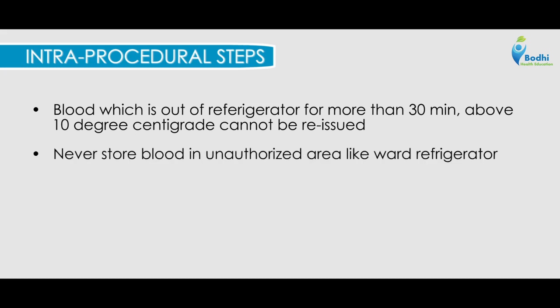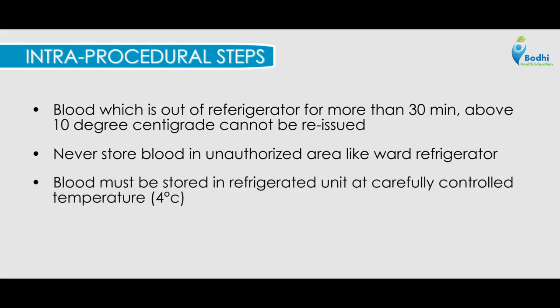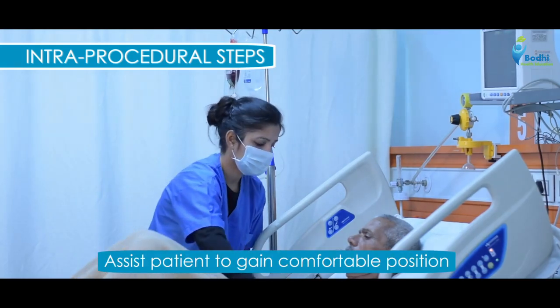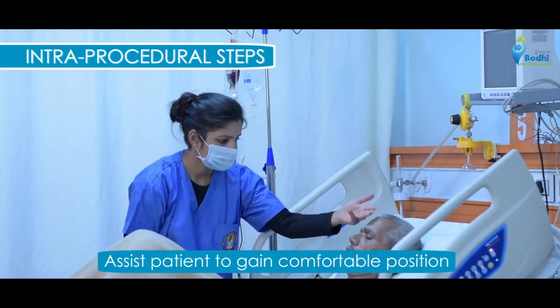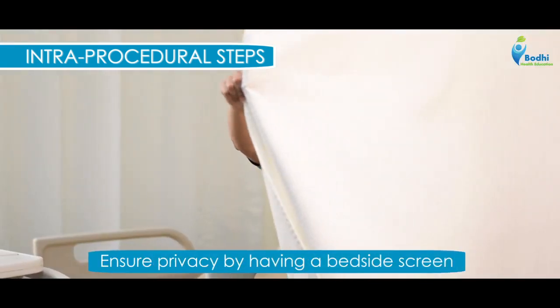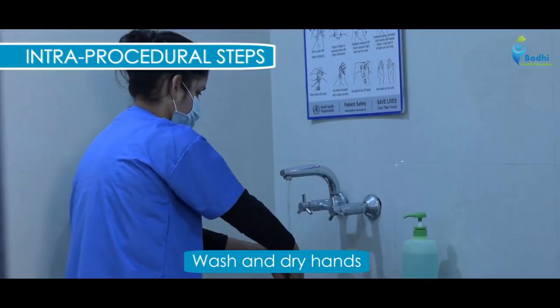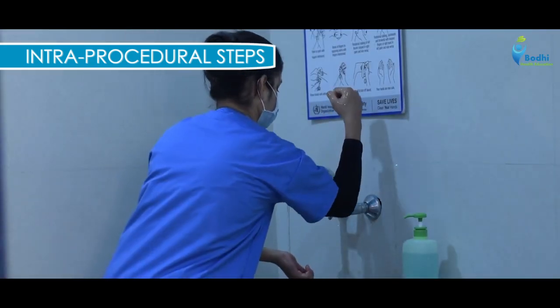Never store blood in unauthorized area like ward, refrigerator. Blood must be stored in refrigerated unit at carefully controlled temperature, that is 4 degree Celsius. Faulty techniques in storing blood product can cause hemolysis. Assist patient in gain comfortable position to ensure comfort to the patient. Ensure privacy by having a bedside screen. Wash and dry hands. Prevent cross infection.